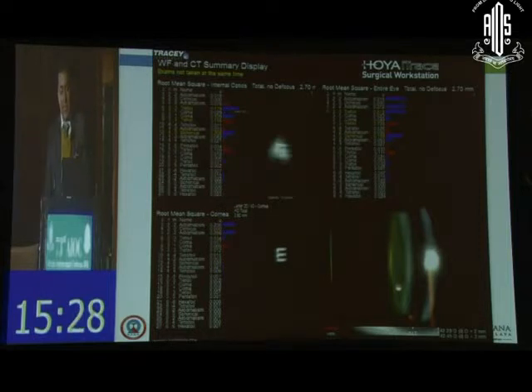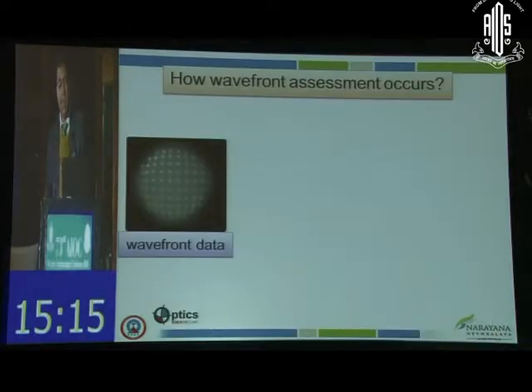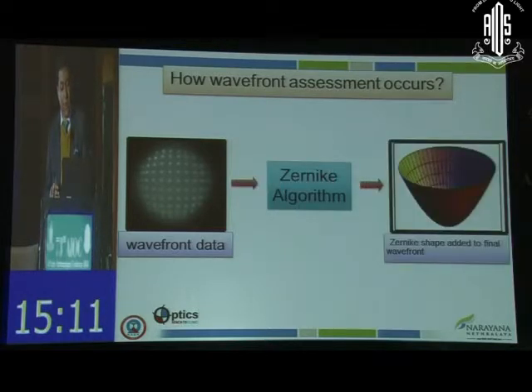Many years back, I used to call it a mathematical cataract. Today, I see a lot of Western people call it dysfunctional lens syndrome, where the lens is having more aberrations and has not reached the stage where it has actually become old. Now, the machine gives you a lot of values. Now, what do I do with these values?